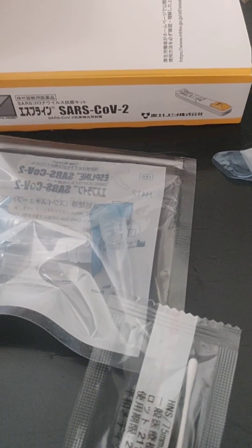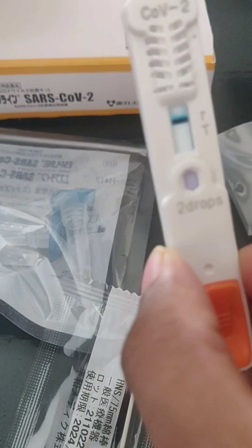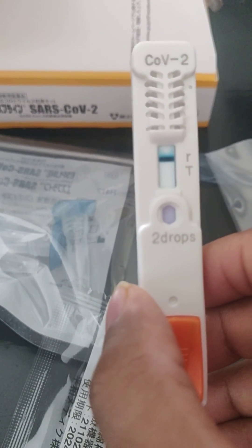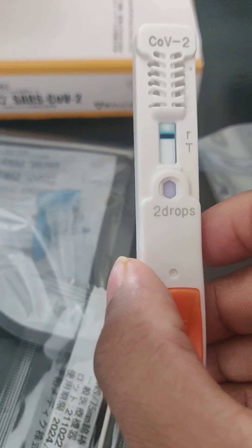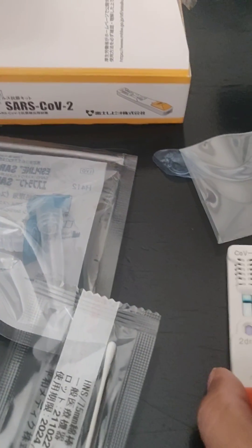I tested mine and I was negative, so I don't have to report anything to the government. If it is SARS-CoV-2 positive, then you have to immediately report to the government and respective departments.